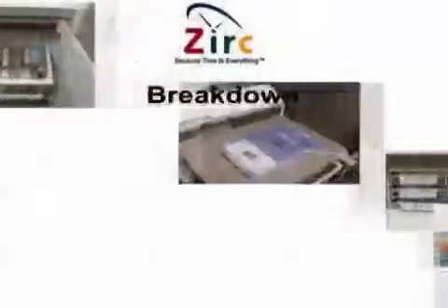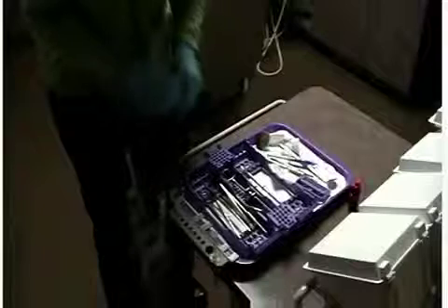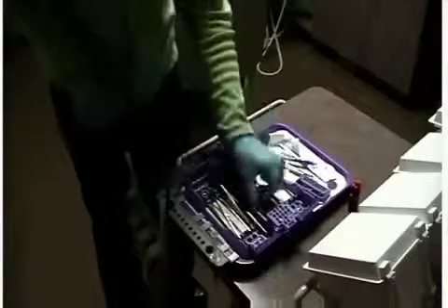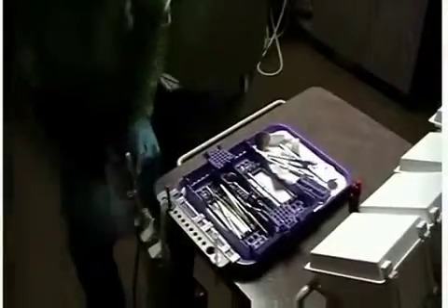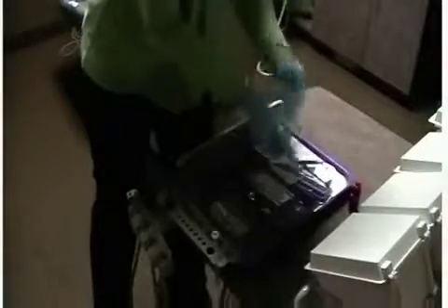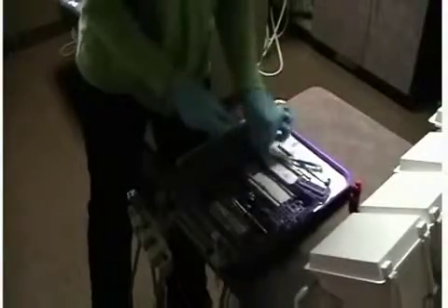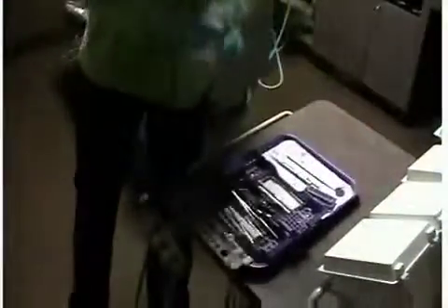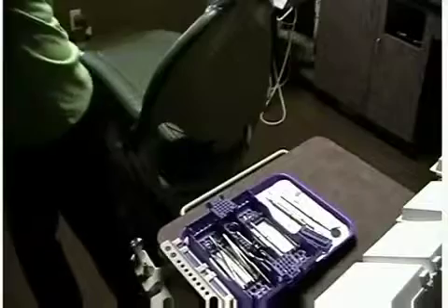Breakdown. The procedure is complete and now it is time to break down your setup. Dispose of all consumable materials at chairside such as the saliva ejector, cotton rolls, needles, and any other single-use items. By disposing of these items now, it will save time in central sterilization when the cleaning process is ready to begin, and it also helps prevent potential injuries that may occur during transportation or sterilization.